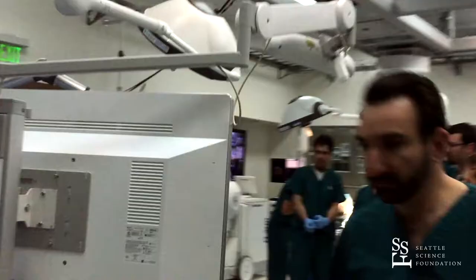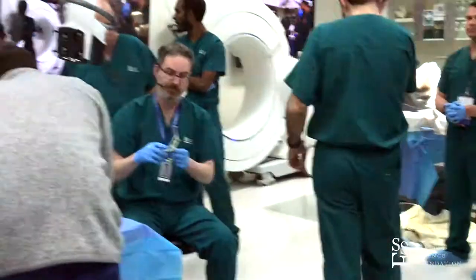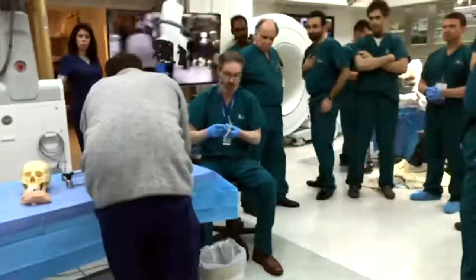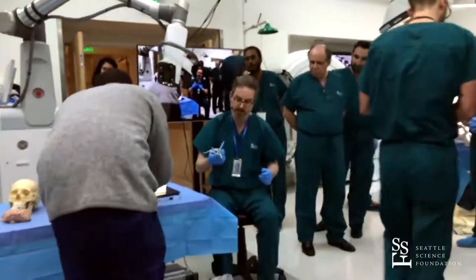As I mentioned, there are two systems that are available on the market. One is the BrainPath from Niko, and one is the Vicor. The BrainPath is the one that I choose to use.